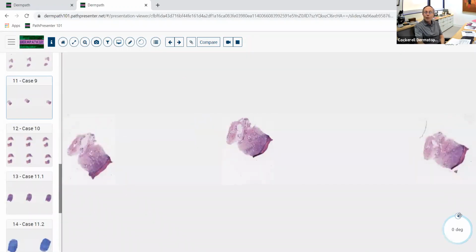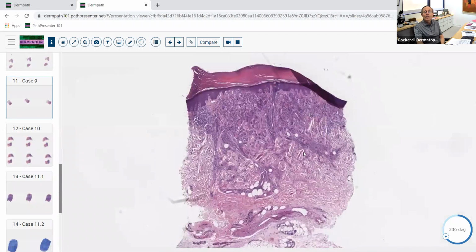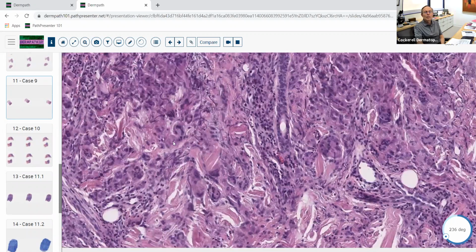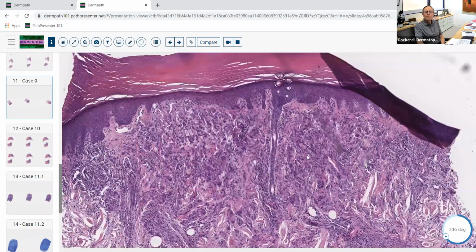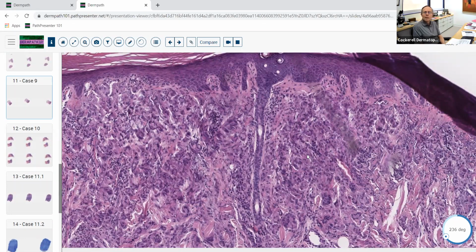Okay, here's another example of granulomatous inflammation, and this is seen on an area where there's a lot of sun damage here. And so we've got lots and lots of histiocytes here. They're multinucleated. There are all these elastotic collagen bundles. They're engulfed by these histiocytes here. So what's the diagnosis in this case? Well, in the old days, and I think some people even in the new days still call this actinic granuloma.